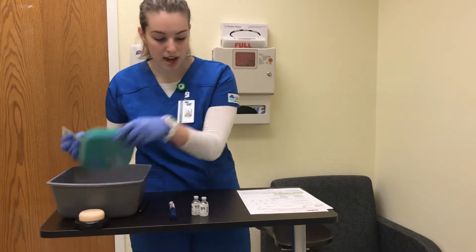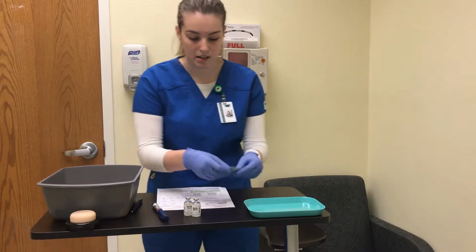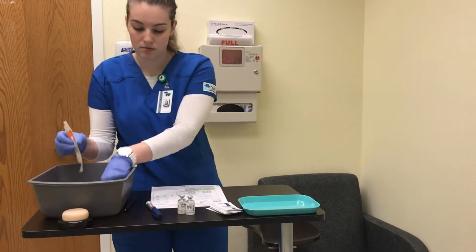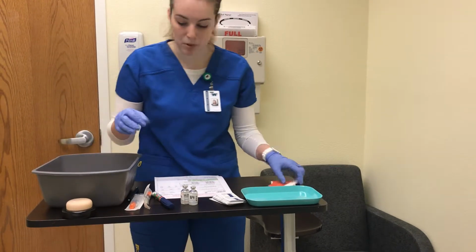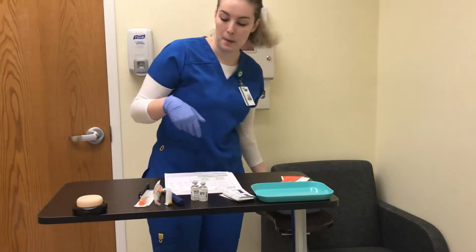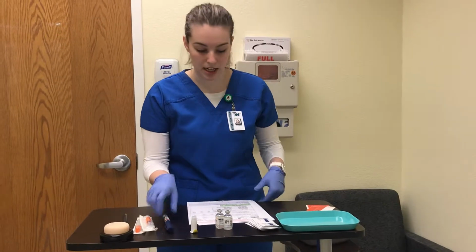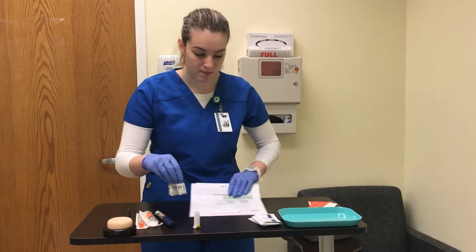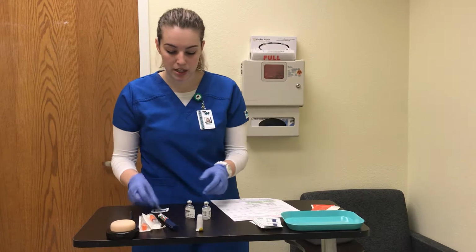So I'm just going to take out of my bin everything that I'm going to need. And I will need some labels as well, and my needle for my insulin pen. Oh, and the onset for the pen is 5 to 15 minutes. So now we can begin with my insulin with a needle. So we'll clean the tops off of both of these.